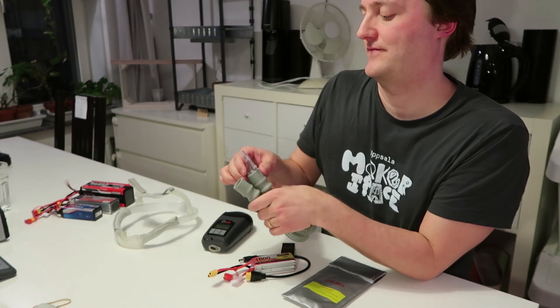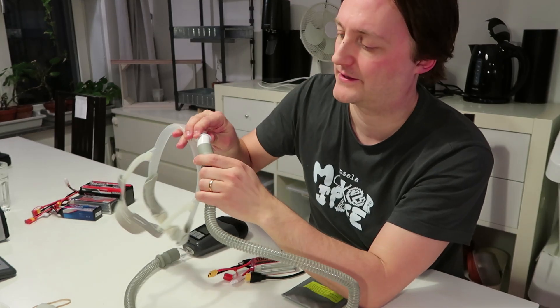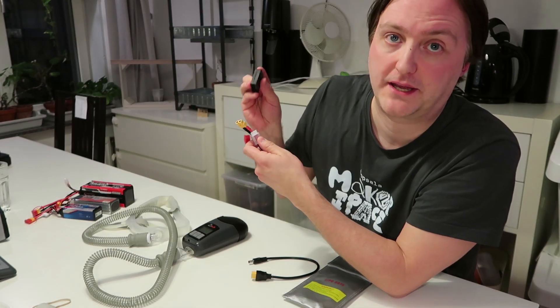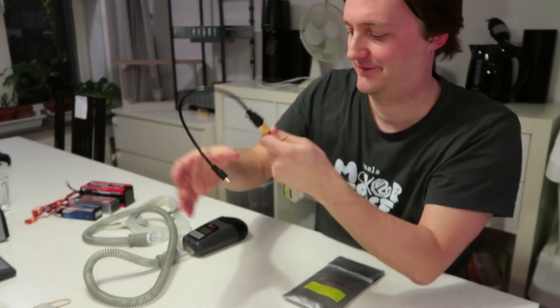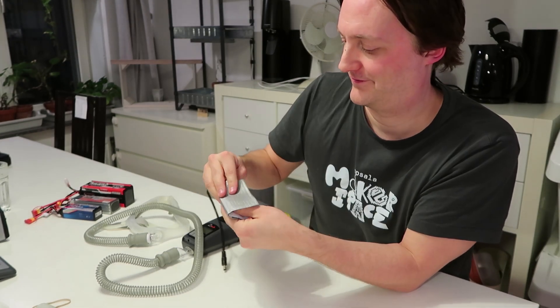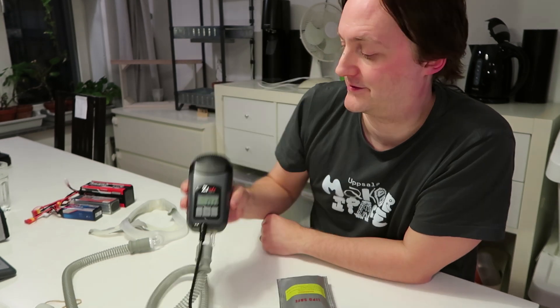Let's assemble everything. First I plug in the hose to the CPAP, then I plug in the hose to the mask. Then I plug in the battery monitor to the battery, and the adapter cable to the battery, and put the battery in the protective bag. Lastly I plug in the power cable to the CPAP, and the CPAP will power on automatically. It's ready to use.